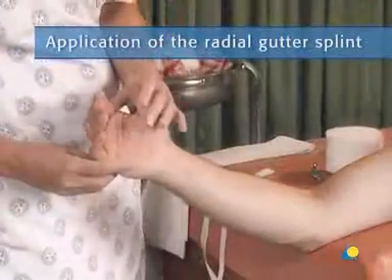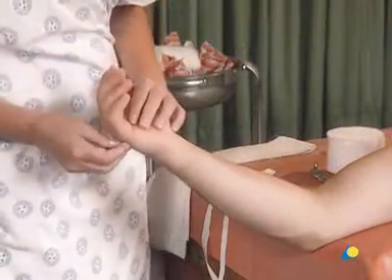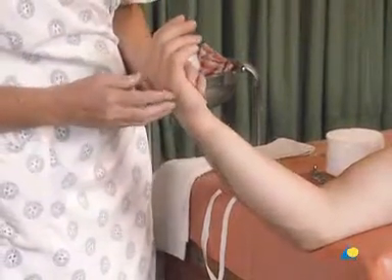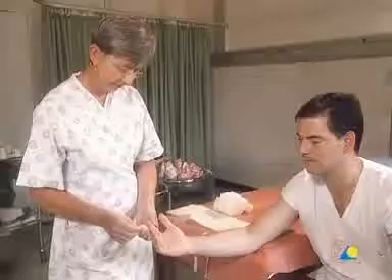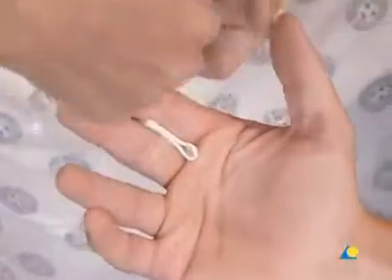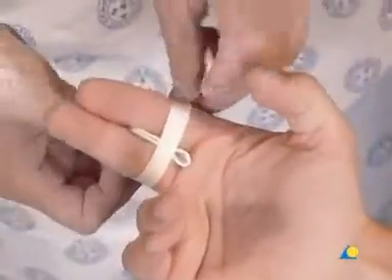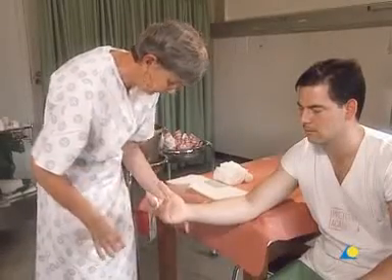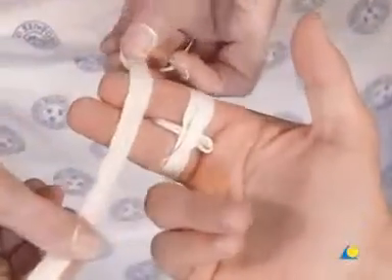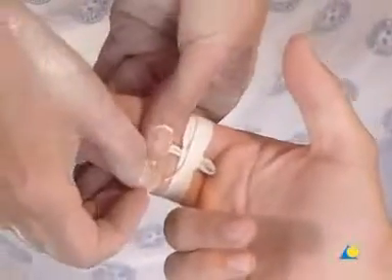To begin, the patient's hand is examined for rotation of the metacarpals. To correct any rotation or prevent the introduction of any rotational deformities, the second and third fingers are buddy splinted. A piece of gauze is placed between the fingers and they are taped together. The material prevents skin maceration from skin-on-skin contact. The fingers should lie side by side in the same plane.